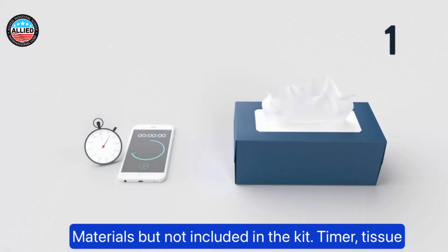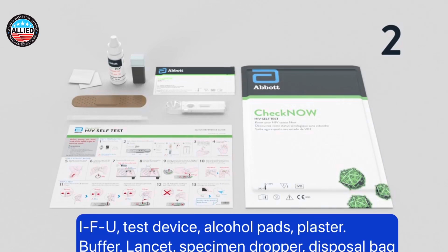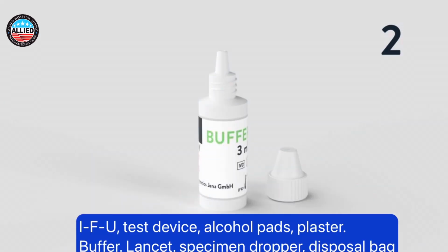Materials but not included in the kit: timer, tissue. Included in the test kit: IFU, test device, alcohol pads, plaster, buffer, lancet, specimen dropper, disposal bag.